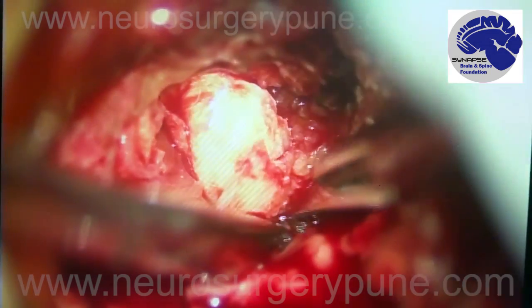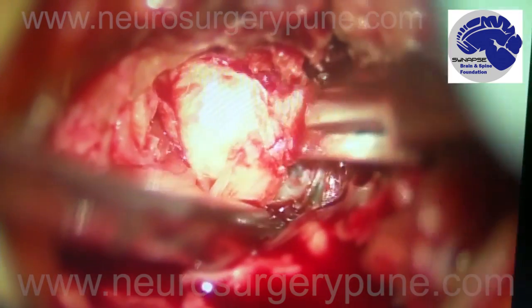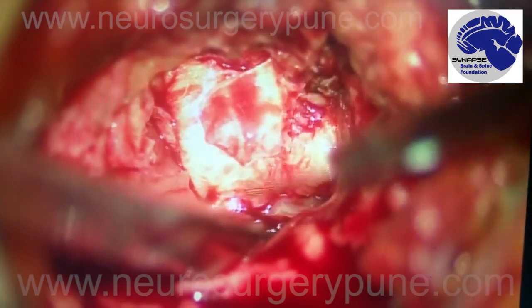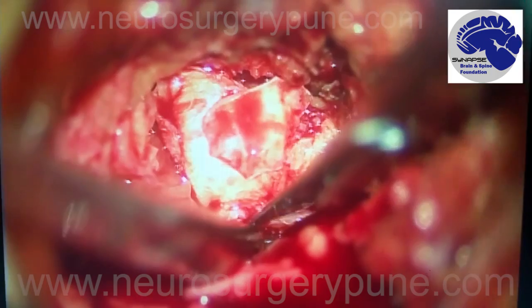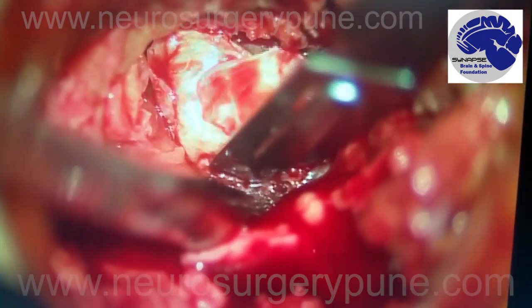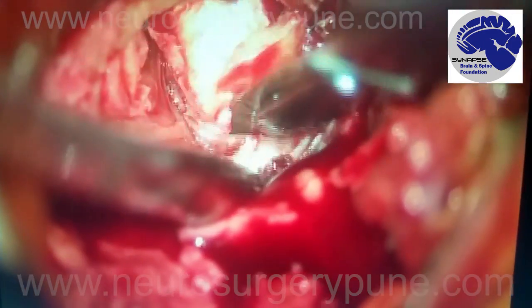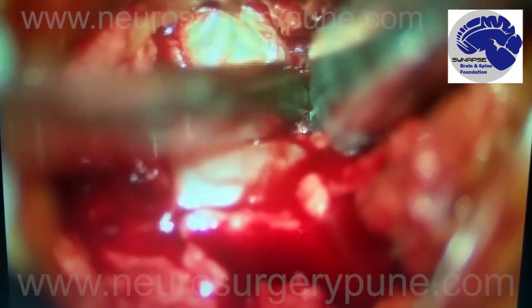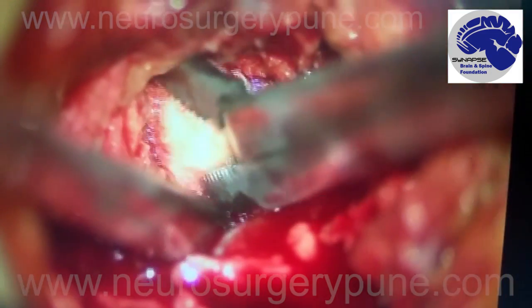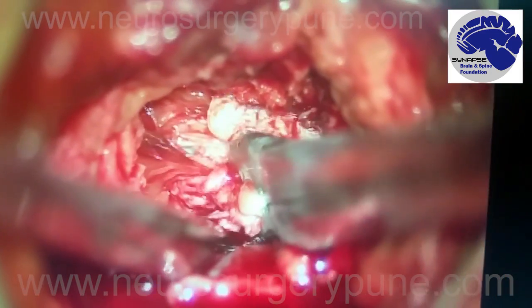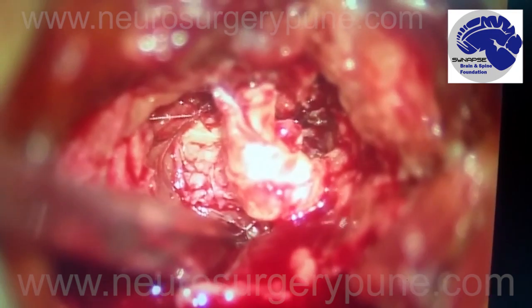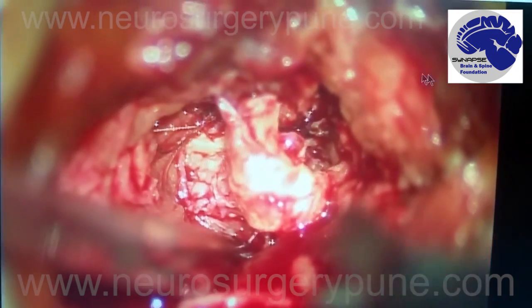Now after this disc is removed, the nerve is decompressed and the pain vanishes. This is the part of the disc which was really causing the problem.